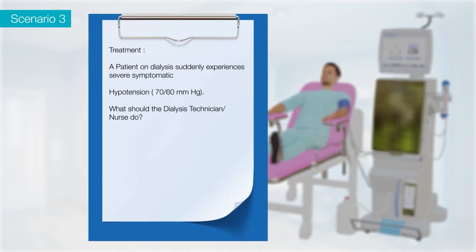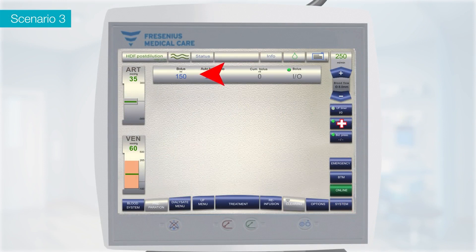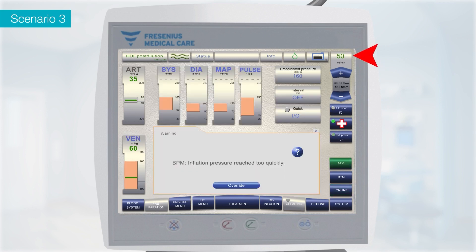Scenario 3: A patient undergoing dialysis suddenly experiences severe symptomatic hypotension with a blood pressure of 70/60 mmHg. Select the options menu on the 5008S screen and click on the emergency icon. On doing so, UF switches off automatically and a bolus of 150 ml is delivered automatically. Blood pump speed is reduced to 50 ml/min, and BP is measured automatically.